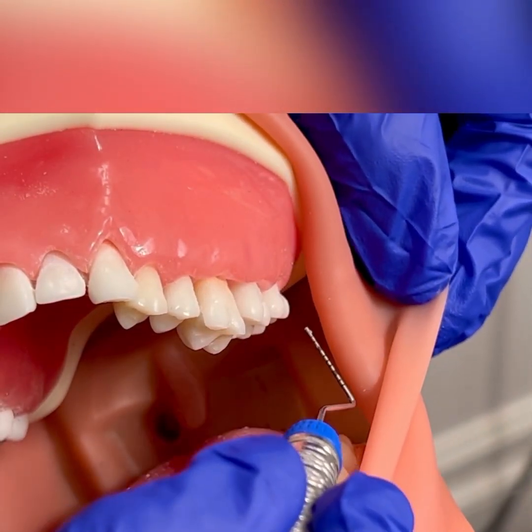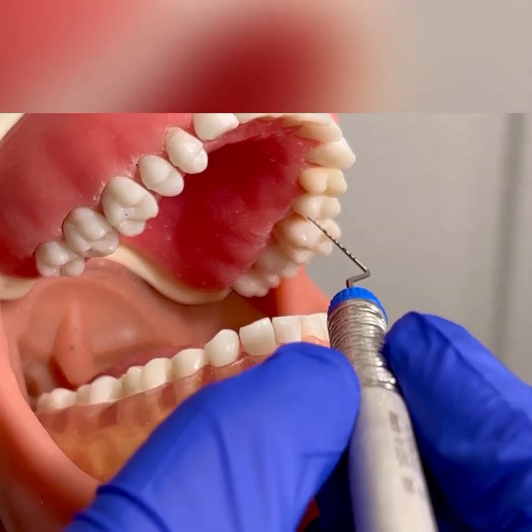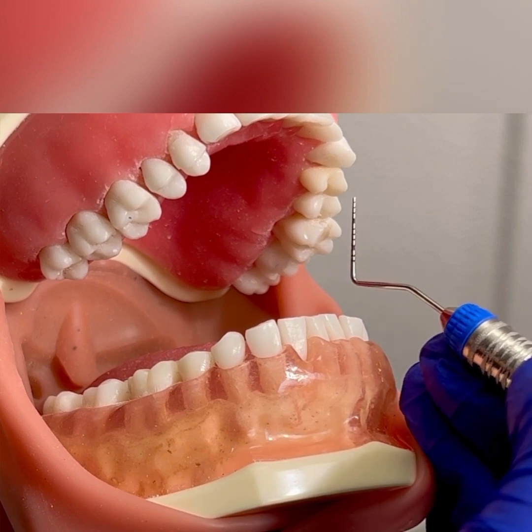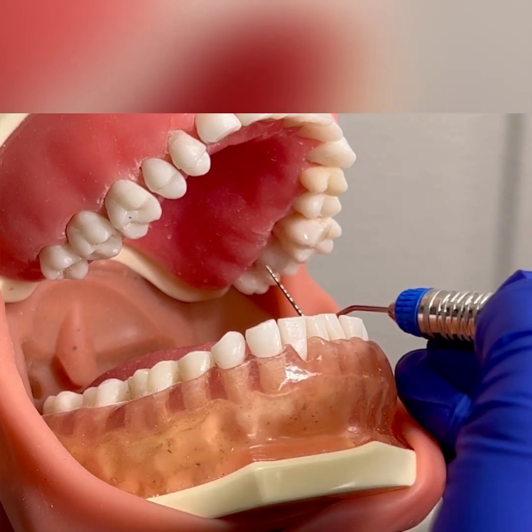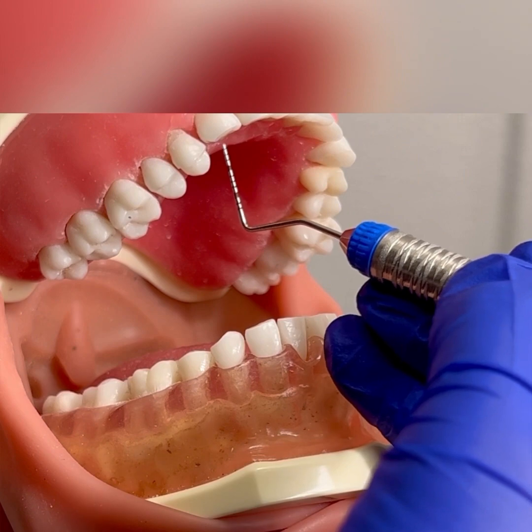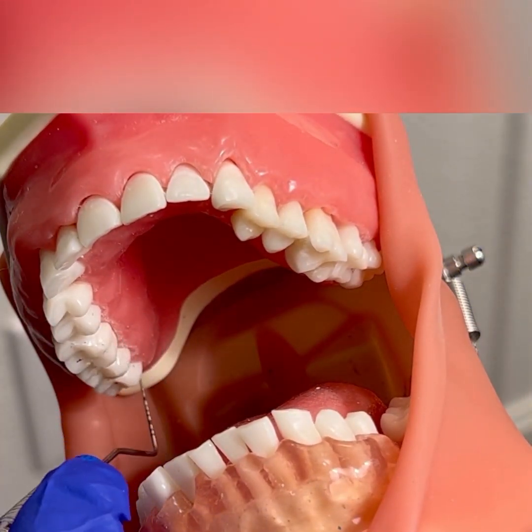Once you finish the buccal surfaces, you would wrap around into the lingual. Chin up, head is away if you're right-handed, sitting at 8 to 9 o'clock. You can use a chin cup, extra oral fulcrum. For left-handed clinicians, you'll be sitting at 2 to 3 o'clock with a palm up extra oral fulcrum, and the head would be turned towards you using your mirror. When you come out to the lingual, you'll start with the distal lingual of tooth number 16, coming all the way across to tooth number six, and then going to the upper right lingual all the way to tooth number one.